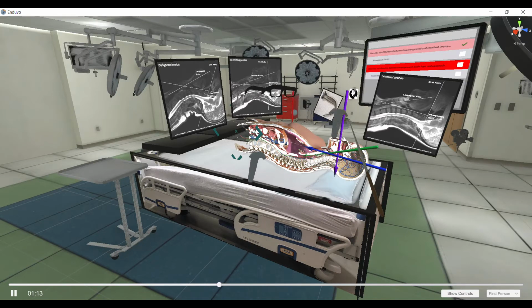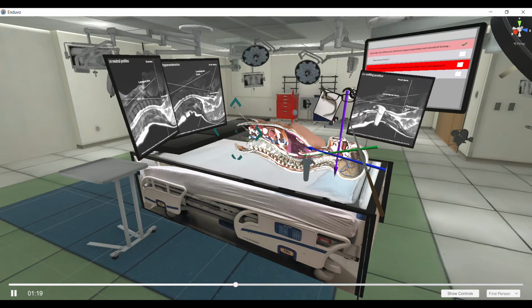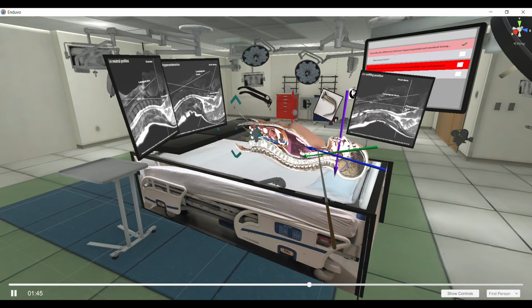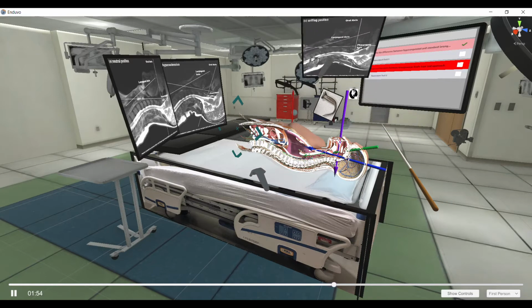In direct laryngoscopy, for most folks, a sniffing position is recommended. And sniffing position involves flexion at the neck and extension of the head, and that better aligns your axes to facilitate direct visualization of your vocal cords so that you can intubate your patient. For obese patients, your approach may change a bit with ramping in order to align your sternal notch and your external auditory meatus. There is ongoing debate about the best intubating position, and that debate is outside the scope of this lesson. We're going to focus more on hyperangulated video laryngoscopy.